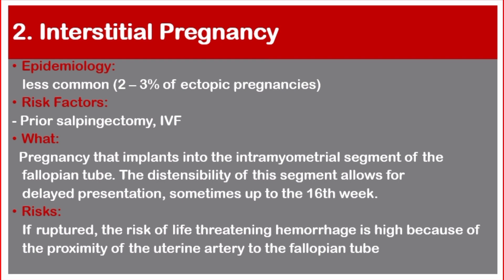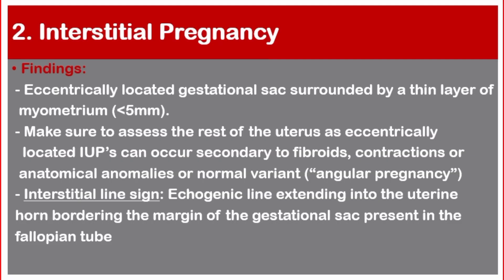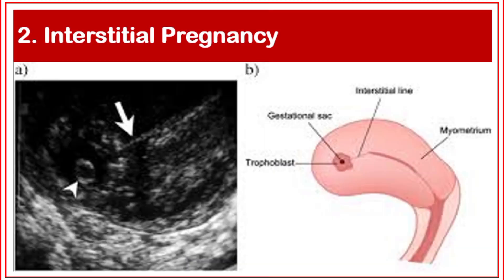If ruptured, the risk of life-threatening hemorrhage is high because of the proximity of the uterine artery to the fallopian tube. This ultrasound picture shows a gestational sac next to the endometrium in a case of interstitial pregnancy; the white arrow shows the empty uterine cavity.